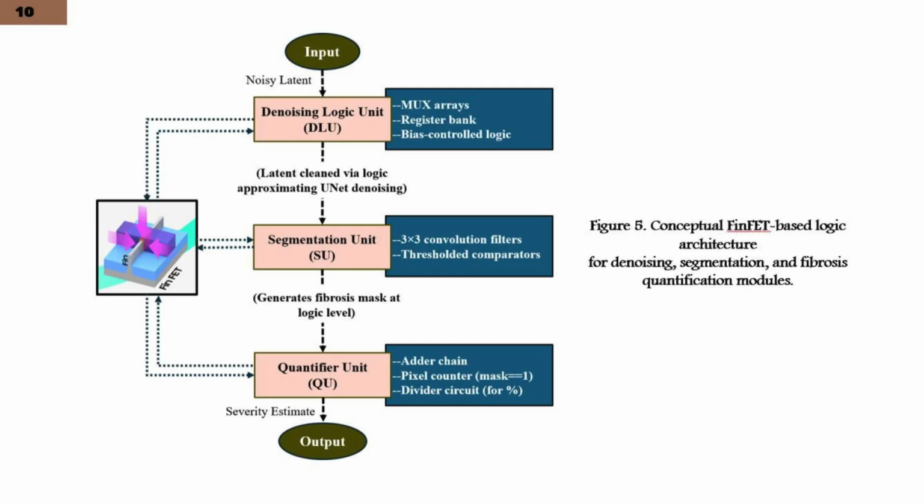This slide presents the FinFET logic architecture overview. To enable future edge deployment, we propose a conceptual FinFET-compatible architecture where the latent diffusion based AI pipeline is mapped into three main logic modules you can see in the figure. The first one is denoising, the second one is segmentation, and the third one is quantification. This design emphasizes low power consumption and hardware efficiency, which is suitable for medical edge devices, and it can be deployed in clinical application.